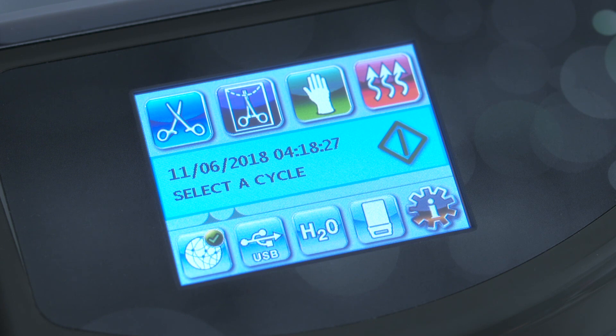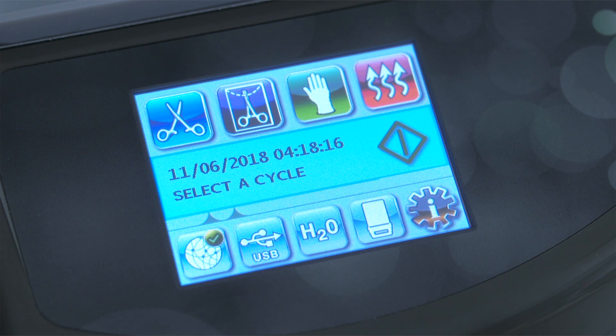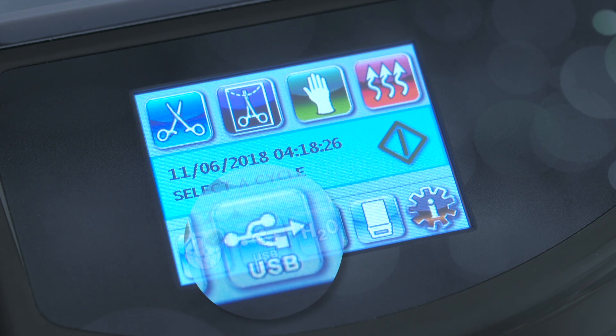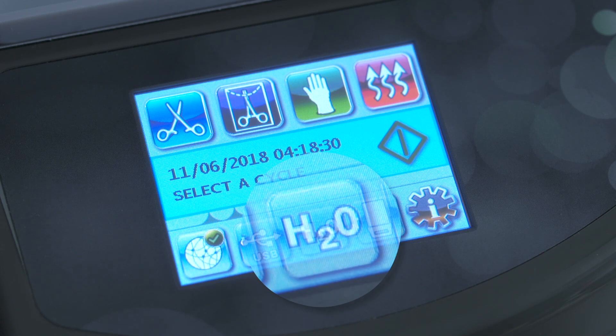On your STATUM 2000 unit, the fourth icon is the air dry icon, which may be used to promote further drying. This icon on the STATUM 5000 unit is the heavy-duty unwrapped cycle, which can be used to sterilize larger loads of unwrapped metal instruments for immediate use. Once the cycle is selected, the start button shown in the middle of the screen is pressed to begin the cycle. Below the start button are status icons for network connectivity, USB storage device, water level and quality, and cassette insertion.